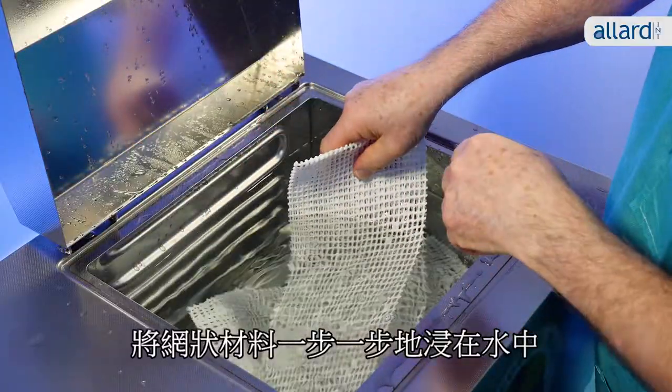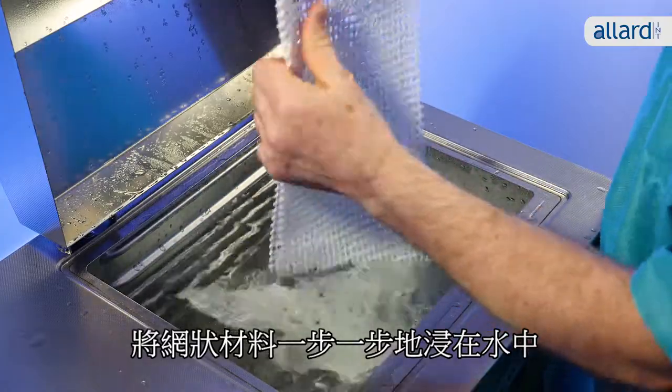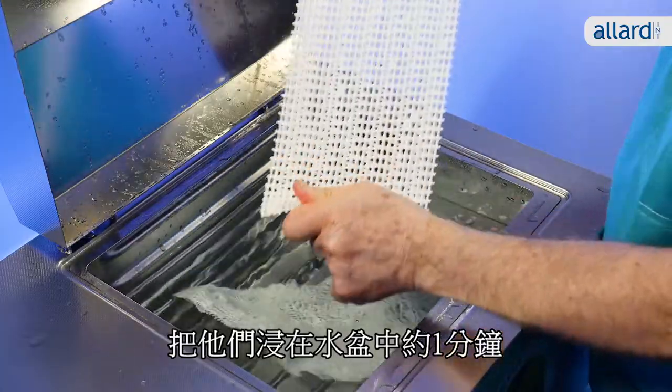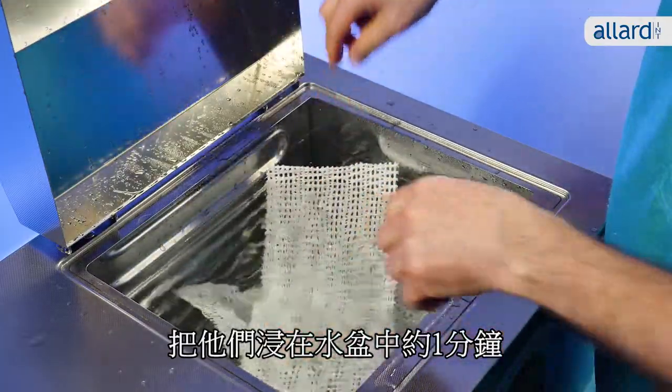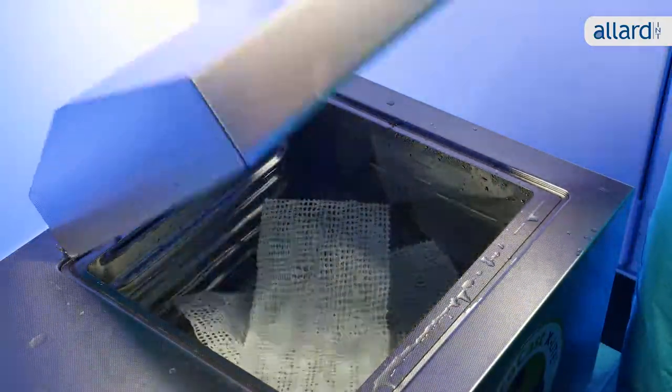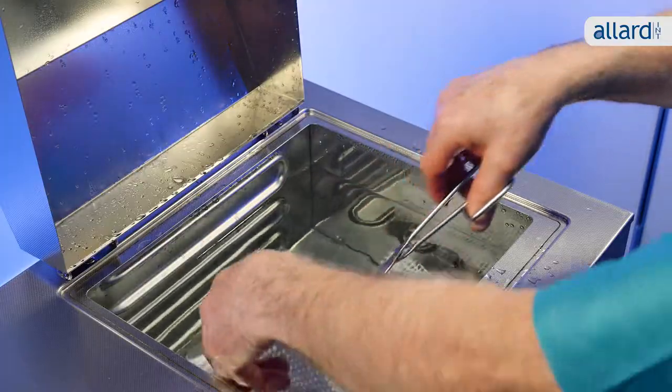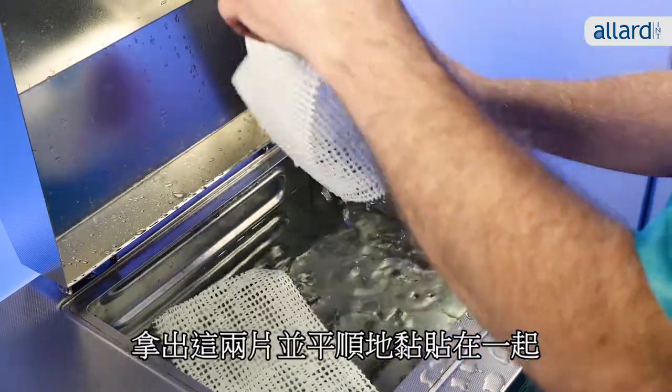Prepare the splints by dipping them in the water step by step. Leave them in the water bath for approximately one minute. Remove the pieces and smooth the layers firmly.